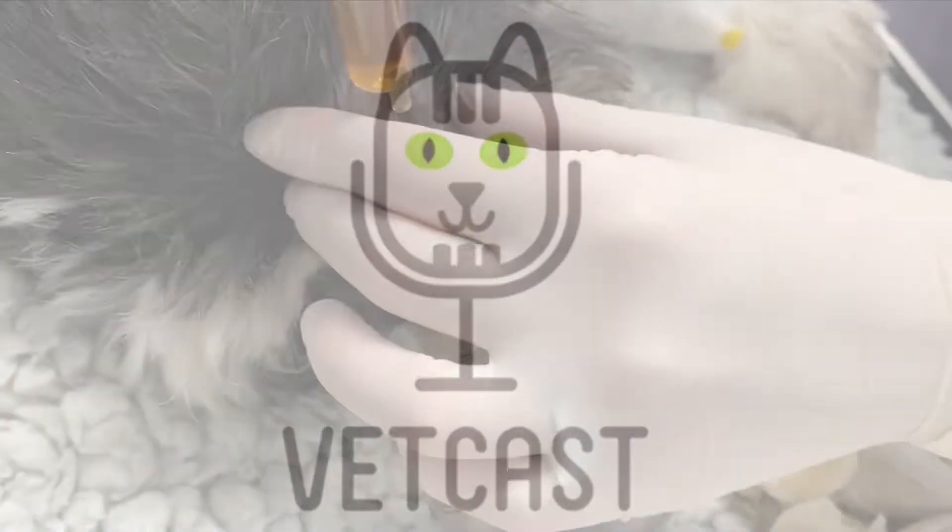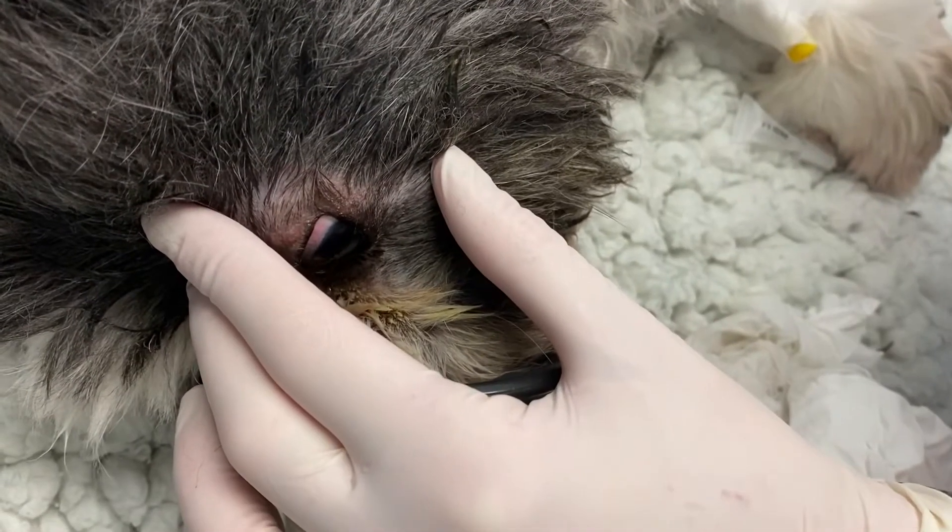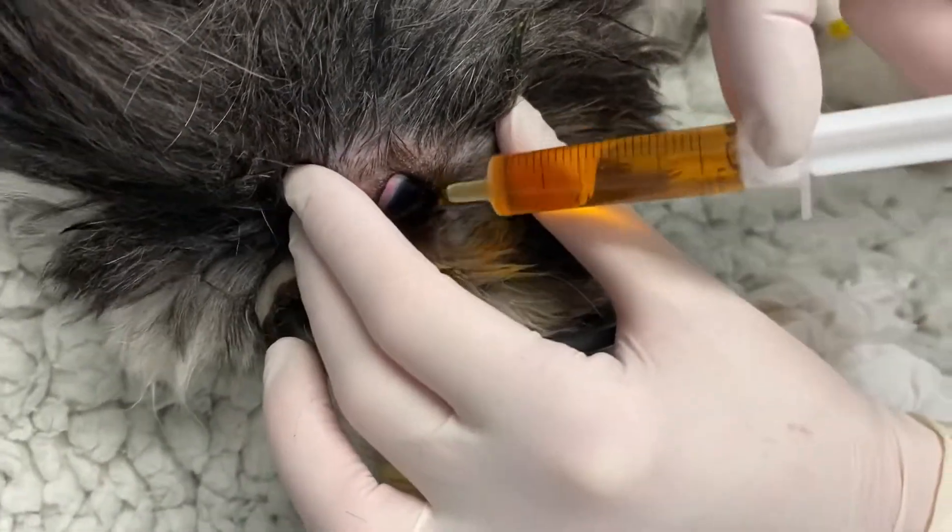In this video, we'll look at how to treat an indolent corneal ulcer with the Diamond Burr procedure.